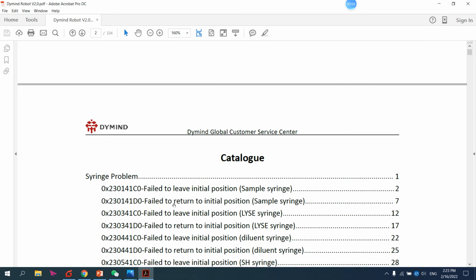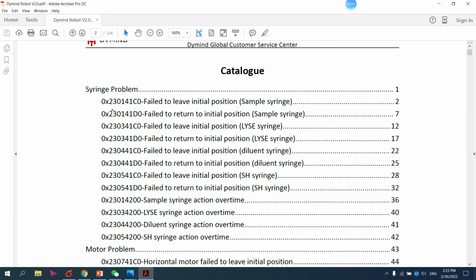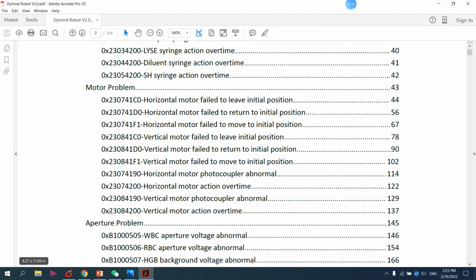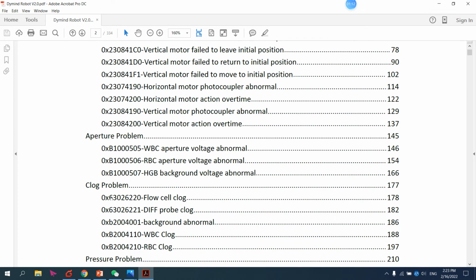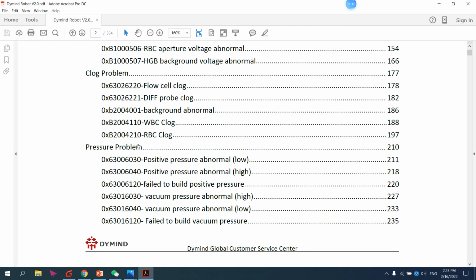go down. Here is the catalog, right? In the catalog there are many topics. Syringe, if you have a problem related to syringe, here are the solutions. Motor problem, solution here. Aperture problem, clog problem, pressure, yeah. So this is the pressure problem.